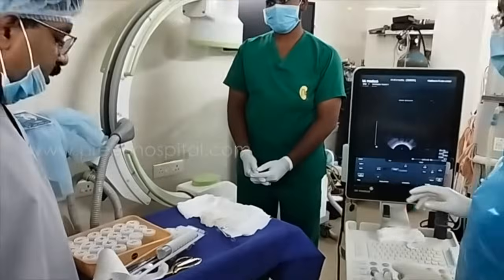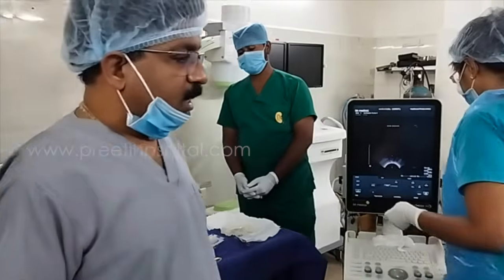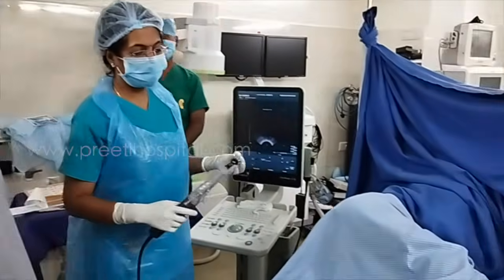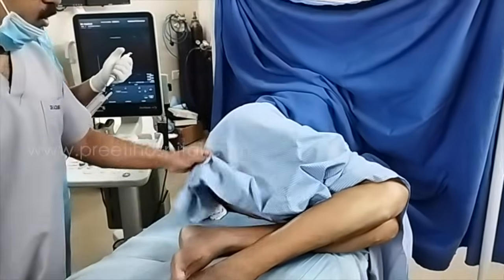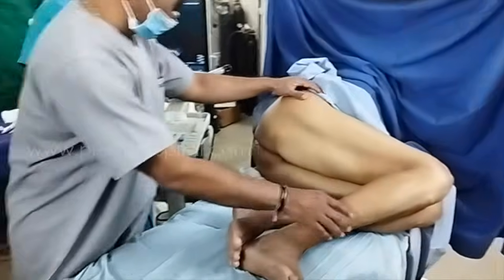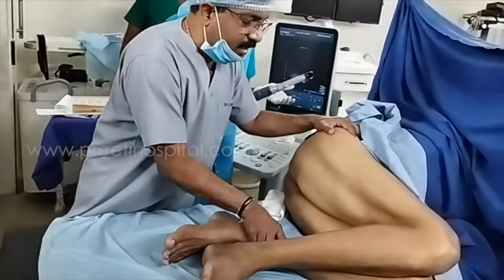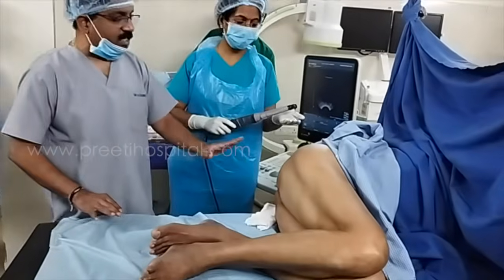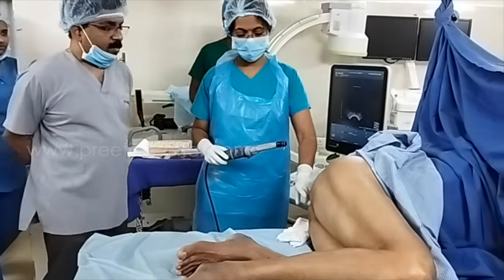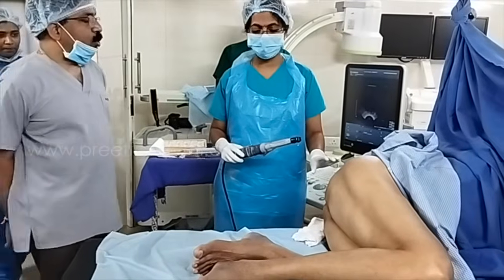Now, when you come to the procedure, what is the position of the patient? The patient is placed in left lateral position. Without identity of the patient, with educational purpose, we are showing this. This leg is flexed a little bit. Do you inject Xylocaine jelly 10 minutes before? We inject Xylocaine jelly locally, just 5 to 10 minutes before the procedure.